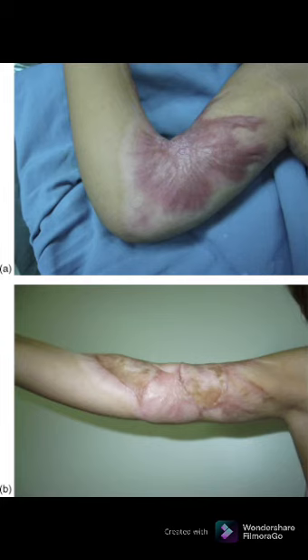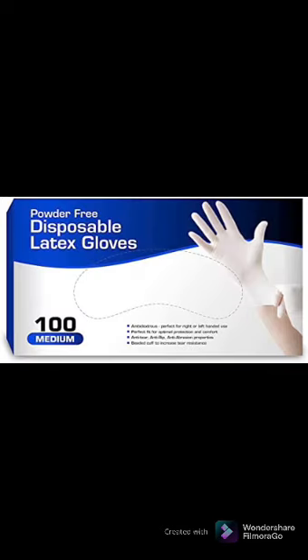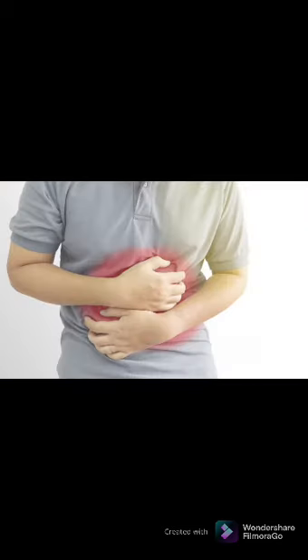Possible venipuncture problem sites: burns, scars and tattoos, edema, hematoma, mastectomy, also known as the removal of a breast, and damaged veins. Possible patient complications and conditions: allergies to equipment and supplies, for example latex gloves. Excessive bleeding due to aspirin tablets if the patient is using the medication. Fainting or syncope and pain.